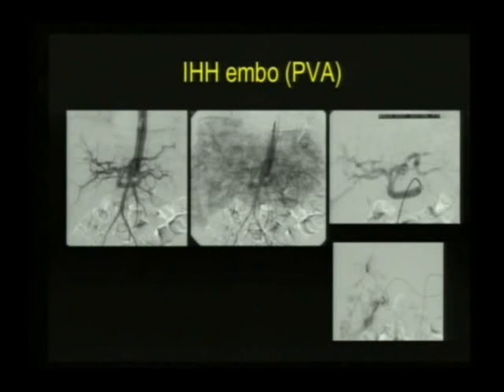So you can close some of these lesions, the infantile hemangiomas, with a variety of embolic agents, and if there's not significant shunting, you can actually reduce some of this hypervascularity. And usually, if you haven't got shunts, you don't have cardiac failure. But interestingly, this baby did have a mild degree of cardiac failure, and we did the embolization here.